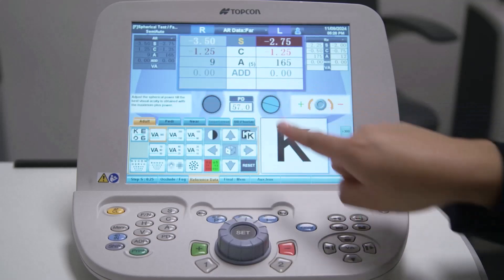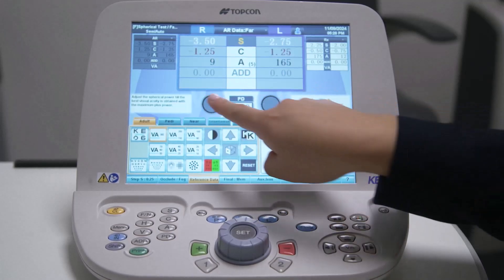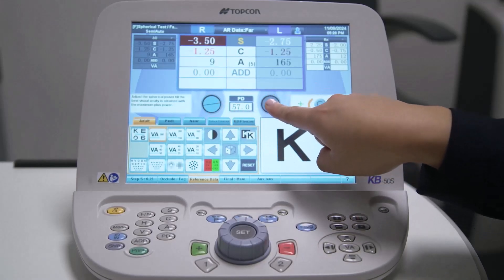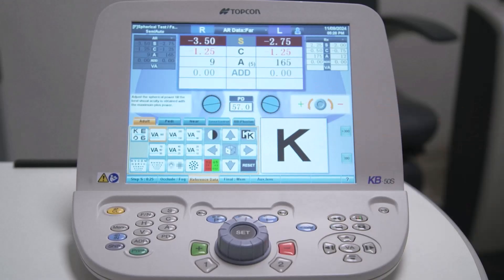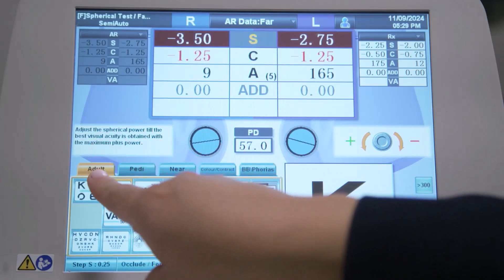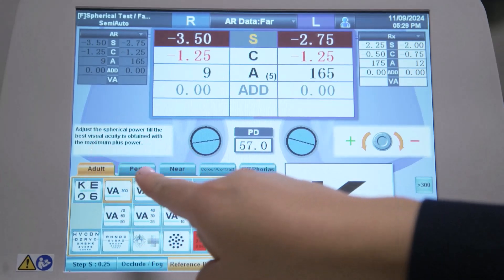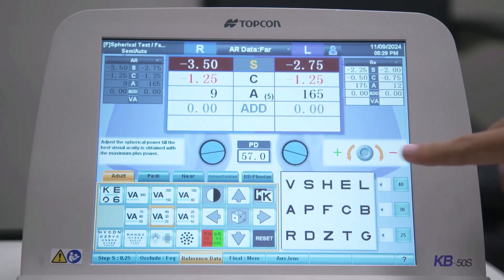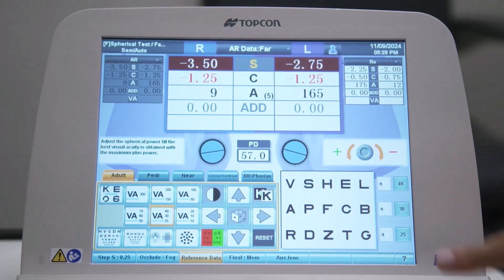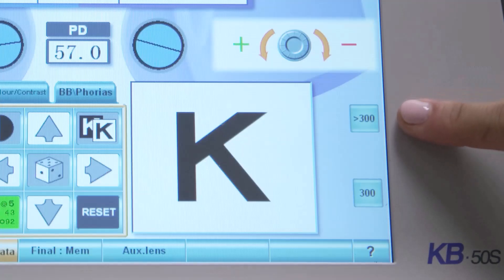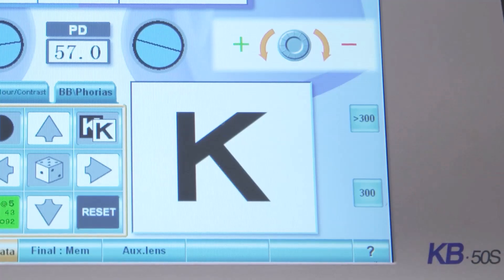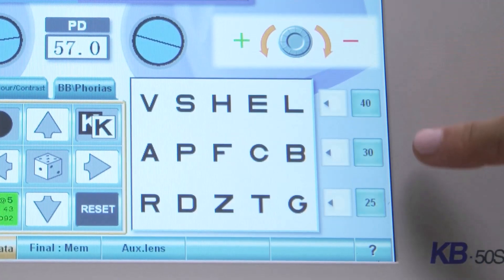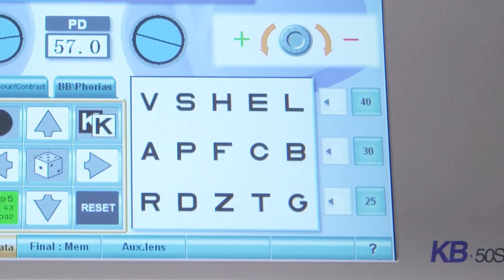Selecting the aperture lens indicator is another way to occlude or open an eye aperture on the CV5000 optical head. The test chart area offers five pages of different test charts to choose from; the available charts will depend on the digital chart model you have connected to your CV5000. To the right is the chart display area, which shows the chart currently in use. The type and functionality of the auxiliary buttons on the right of the chart display will change automatically to match the test being performed.